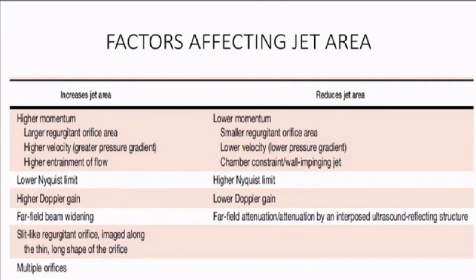When RA pressure is low and RV pressure is high, the TR jet area appears very large. The same severe TR with elevated RA pressure will show a smaller jet area because the pressure gradient between RA and RV decreases. Regarding entrainment: a central jet appears bigger, while the same severe TR with an eccentric jet appears to have a smaller area. In the apical four-chamber view, two jets of equal severity are shown — the central jet appears large while the eccentric jet appears smaller, potentially leading to false underestimation of severity.